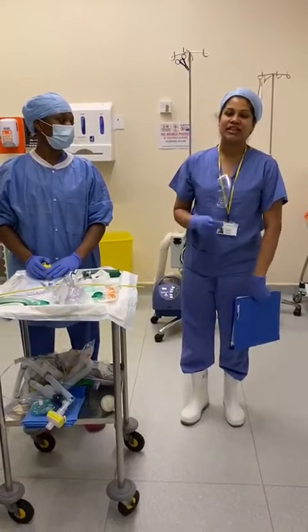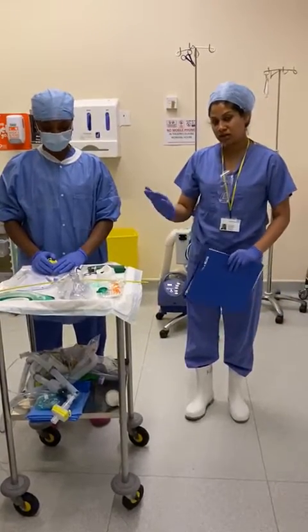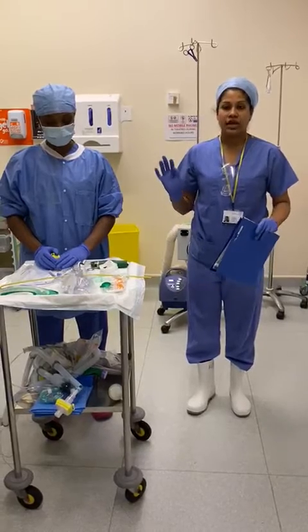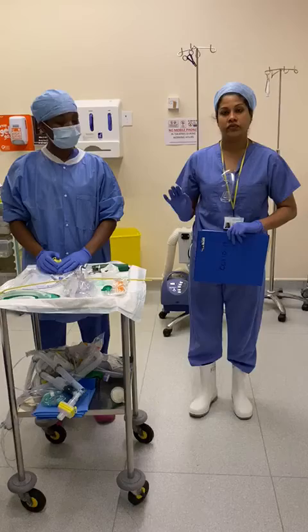My name is Kush. I'm an anaesthetic SHO at Hammersmith Hospital. We're going to do a simulation of intubation of a COVID patient. Imagine you're being called down to HAC for a cardiac arrest of a suspected COVID patient.